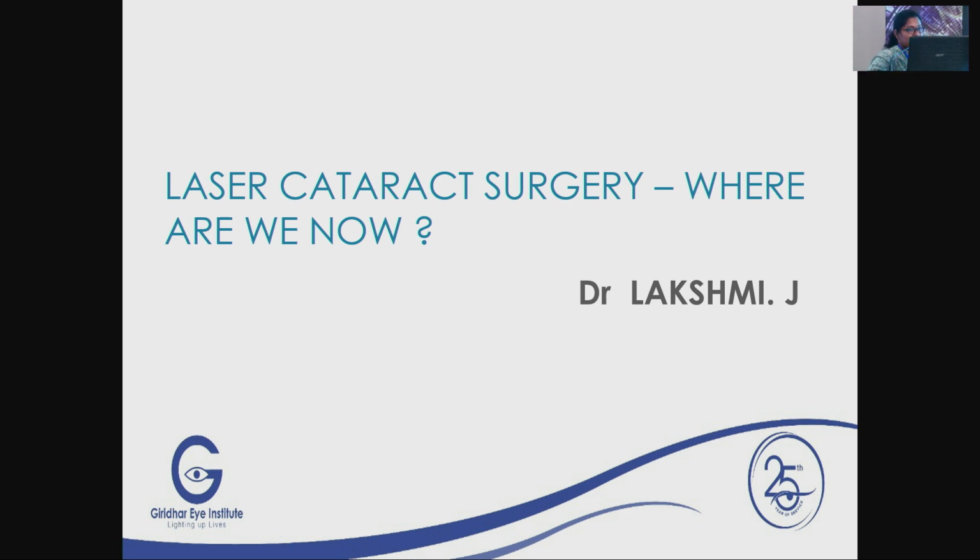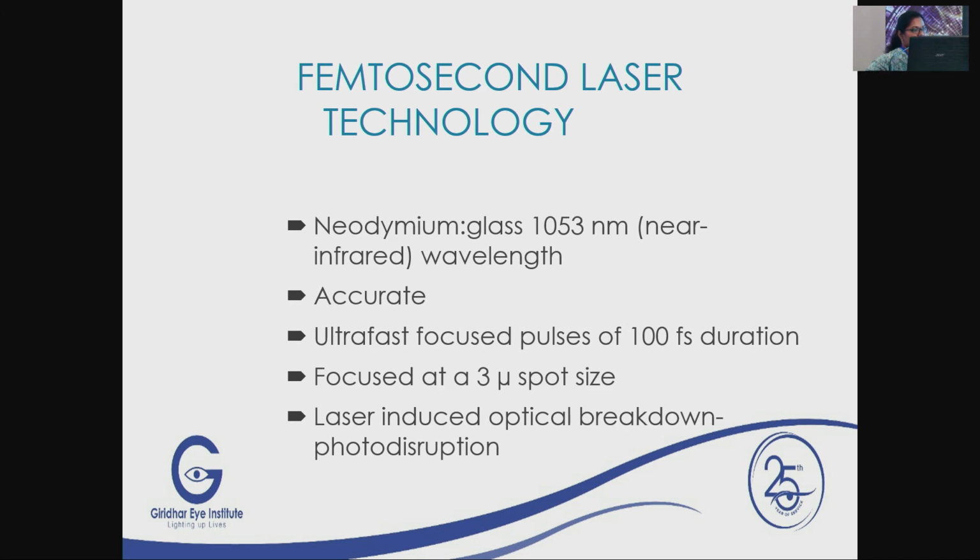So, laser cataract surgery or FLACS, where are we now? This will be my topic. Few words about the femtosecond laser technology. Already it has been discussed by Dr. Sija. It is a neodymium glass, 1053 nanometers near infrared wavelength laser, which is very accurate, ultra fast, and it is very focused up to 3 micrometers spot size.